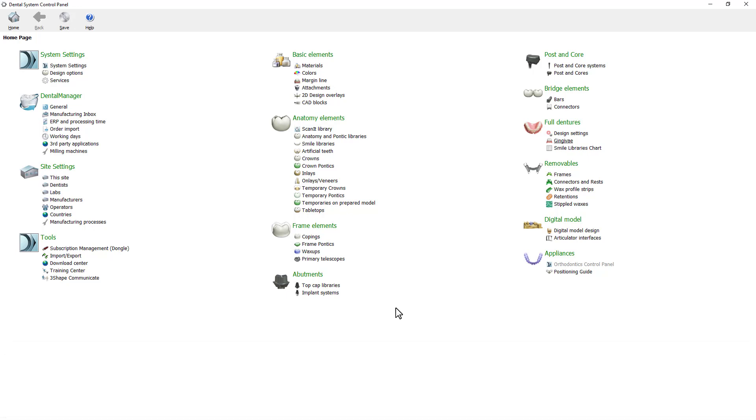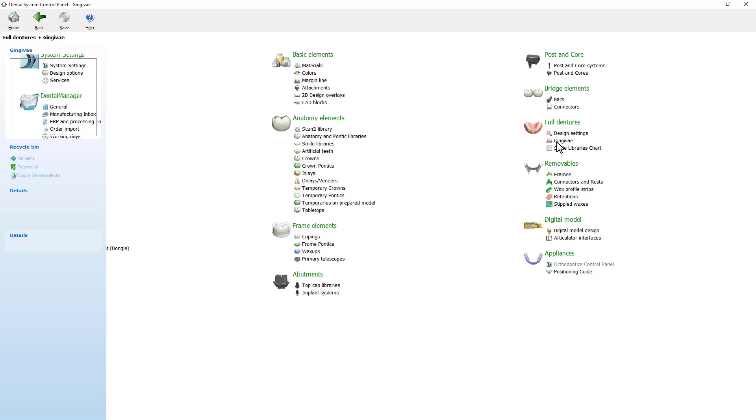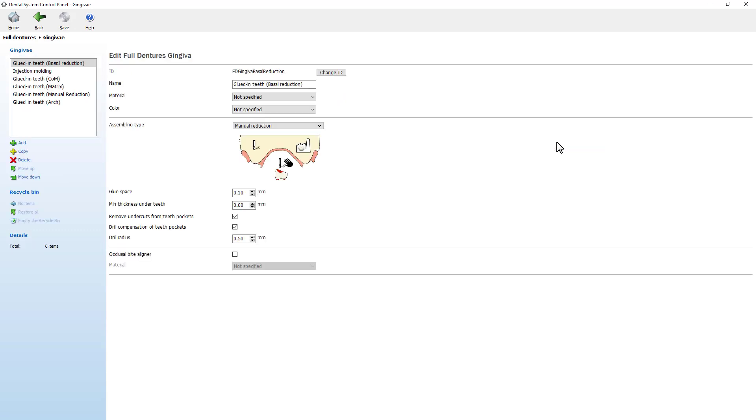To enable the occlusal biter liner option, go to the Dental System Control Panel. In the Dental System Control Panel, go to Full Dentures, then Gingiva to modify the settings. Tick the checkbox for occlusal biter liner and select the relevant material.